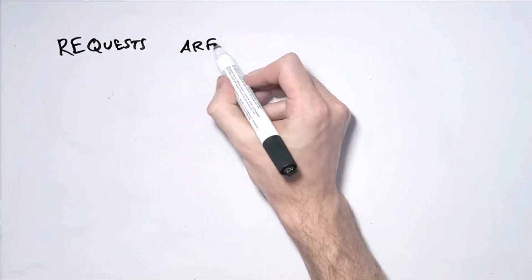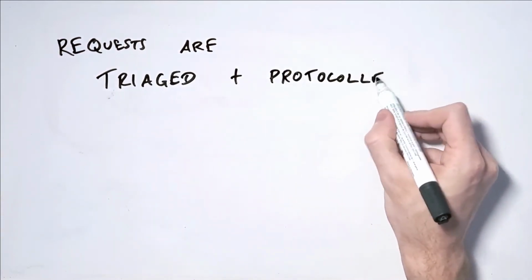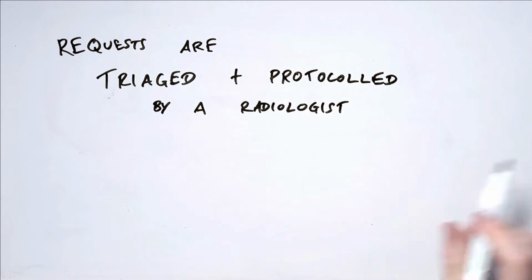Firstly, as with many imaging tests or exams, a physician will submit a requisition with a request for a CT scan of a certain area, for example, a CT head. And before going ahead and completing the scan, the requisition is protocoled and triaged by a radiologist.